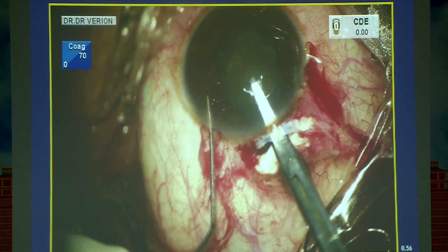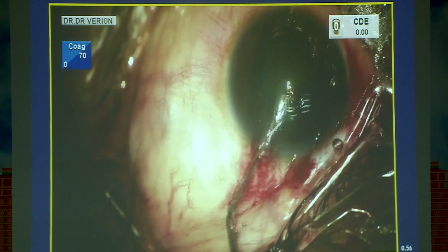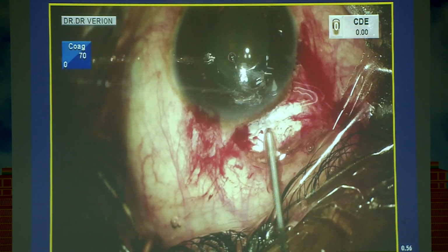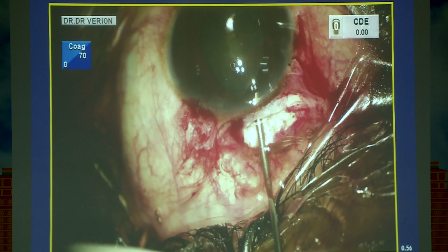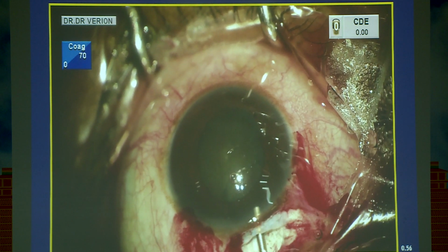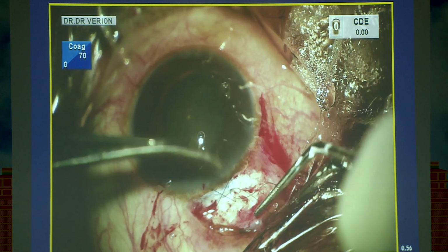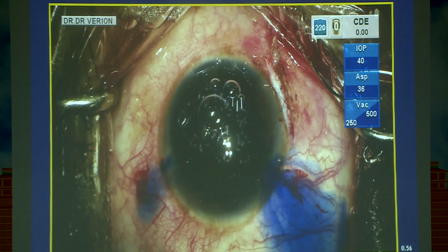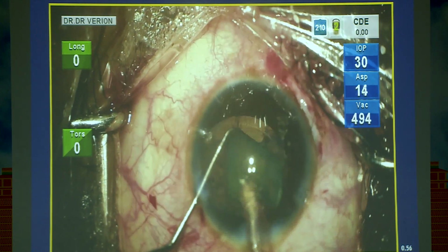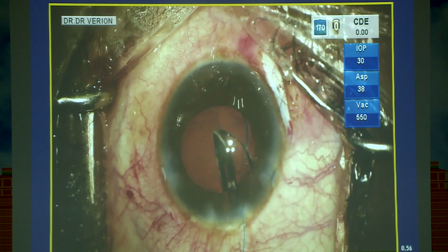Essentially what you do in this is to create a 5 or a 6 millimeter sclerocorneal incision, because that's the PMMA optic size, and then you disenclavate the haptics as you saw in this particular case, and then you just inject a little bit of viscoelastic. Often the endothelial cell count is already compromised in these cases, so your surgery has to be extremely gentle. And then once you have done that, it's a good idea to suture up this incision and then switch over to your temporal clear corneal incision and do the phacoemulsification in the manner that you are accustomed to.